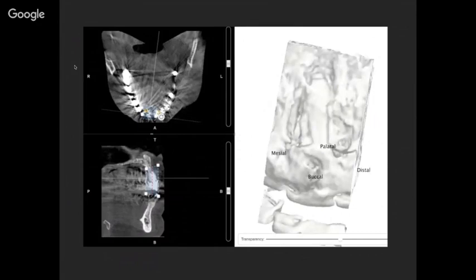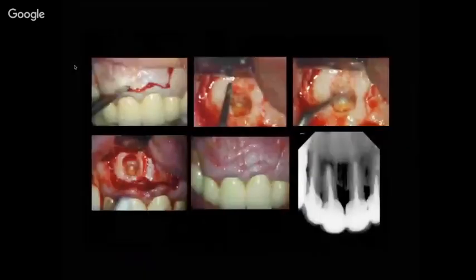I know that I'm going to do it surgically, but I know the extent of the bone loss, which is coronal here. There is a residual part of the bone down in the apical area. To preview guided bone regeneration, in case you have a complete loss of the buccal plate, or in such a case, I can limit my surgery just to a retrograde surgery on the apical part and a retrograde filling.